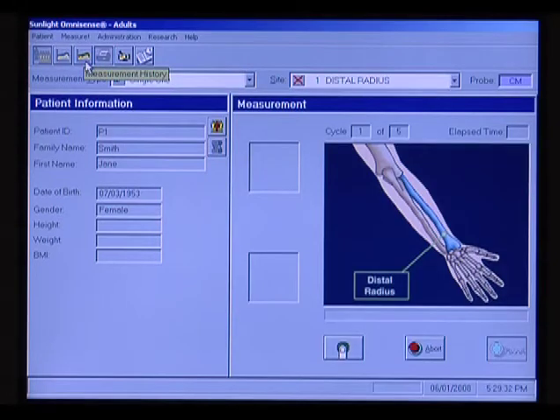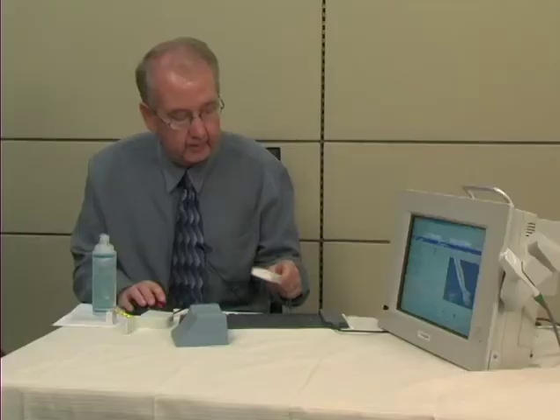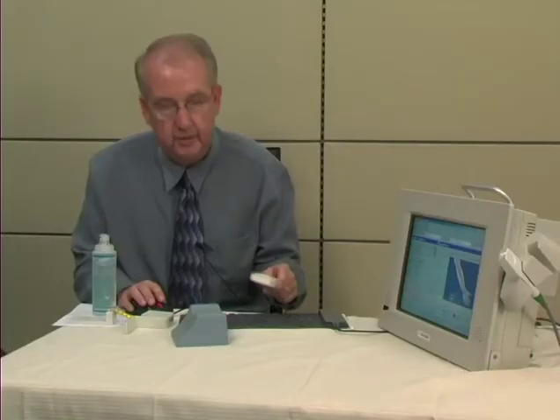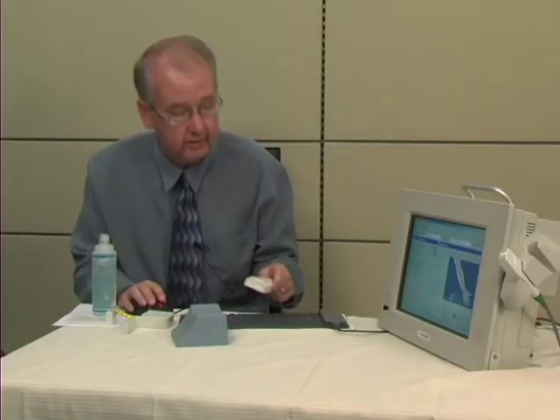You'll see that it reads cycle one of five. And what that means is that we're going to be doing a number of cycles so that the probe is able to do its measurement and get consistent readings.